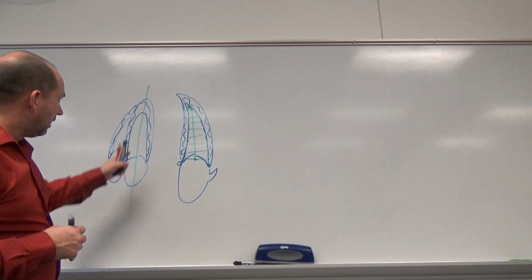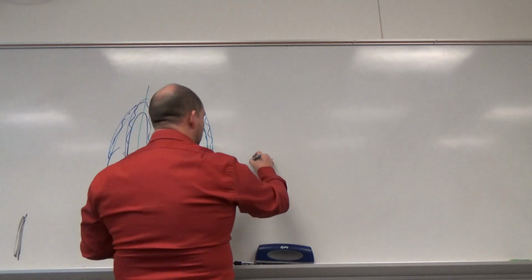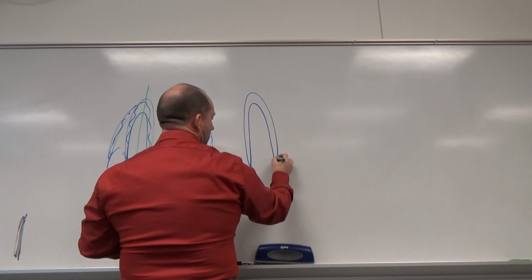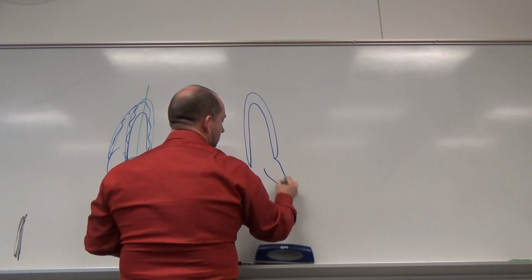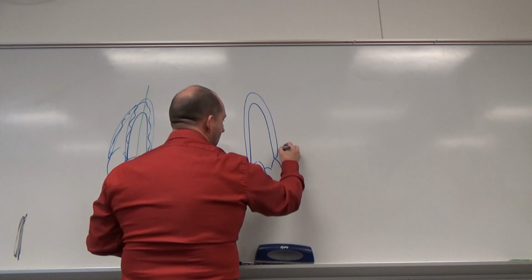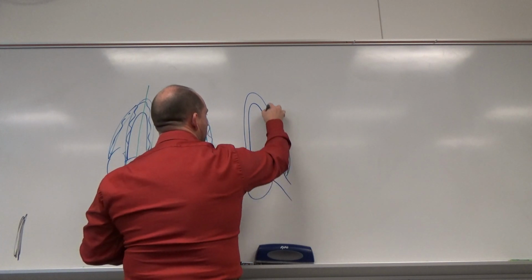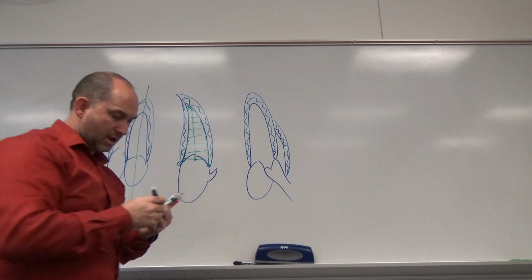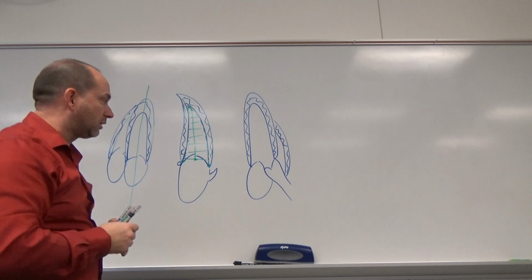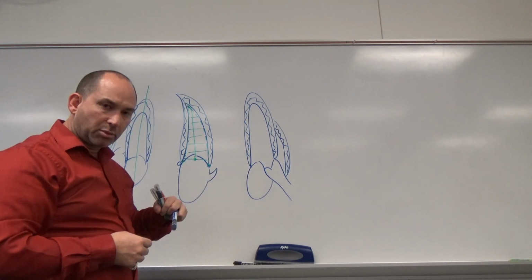Okay, then same perspective that we have, we turn another 60 degrees, and we should end up with almost what we saw in the very first image we took, which is the parasternal long axis. The important part about this long axis is that we need to see both the mitral valve and the aortic valve in the same image. They both need to be opening and closing, although they're going to be at different times.